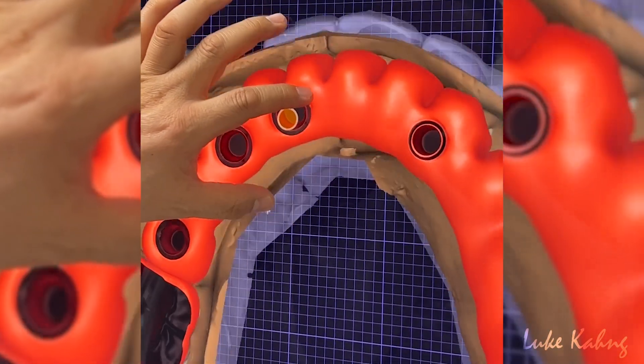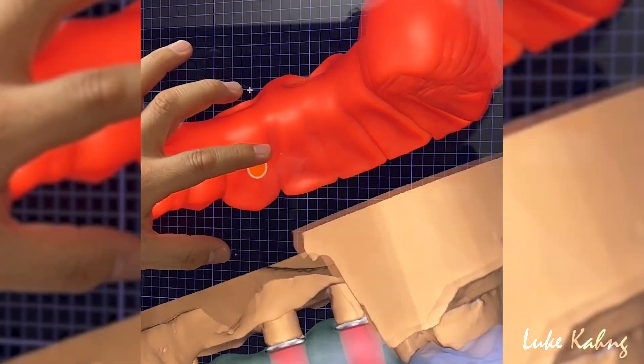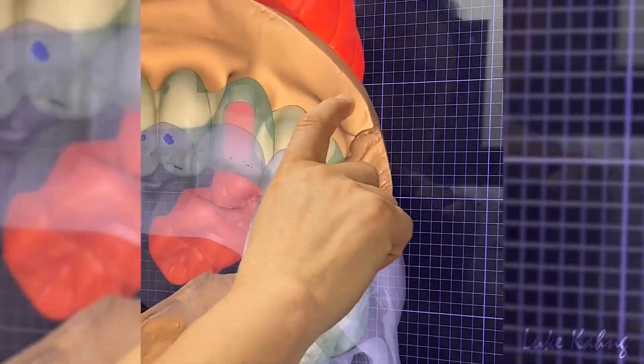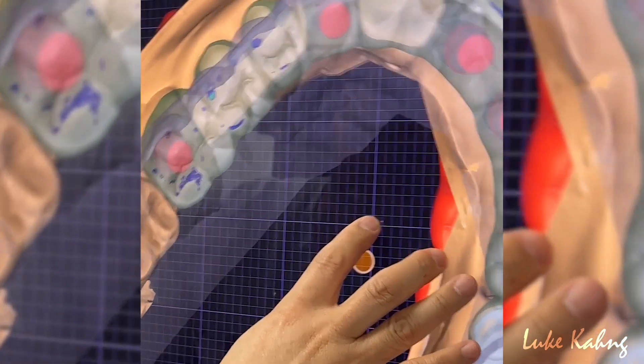We're going to finish this one. We get the better occlusion.